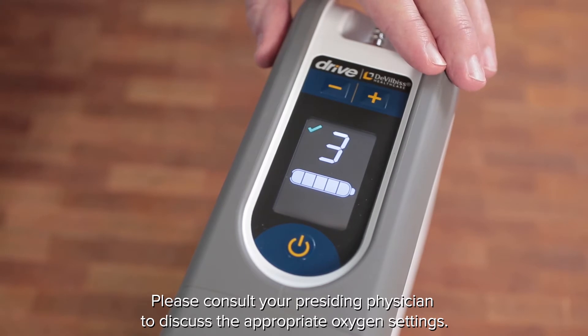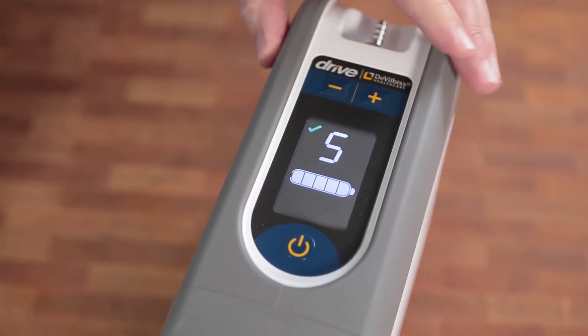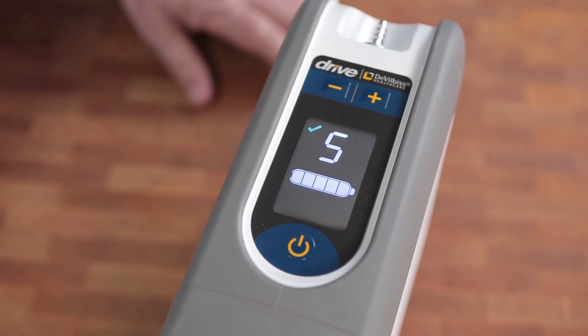To change the setting, press the plus or minus symbol on the main screen to increase or decrease the amount of oxygen being produced. Please note that an increased setting will decrease the battery runtime.